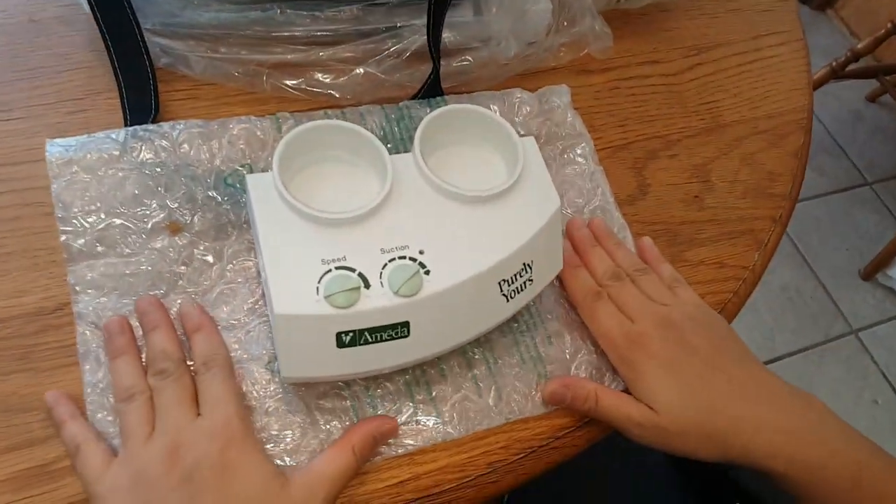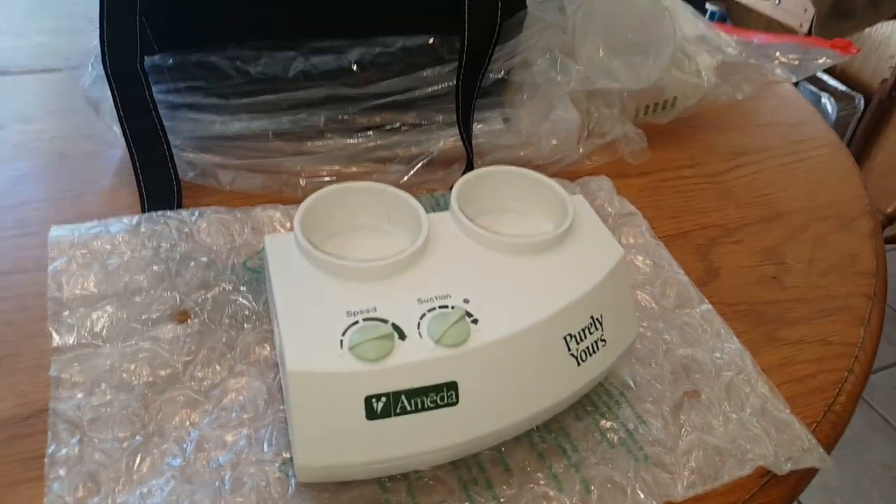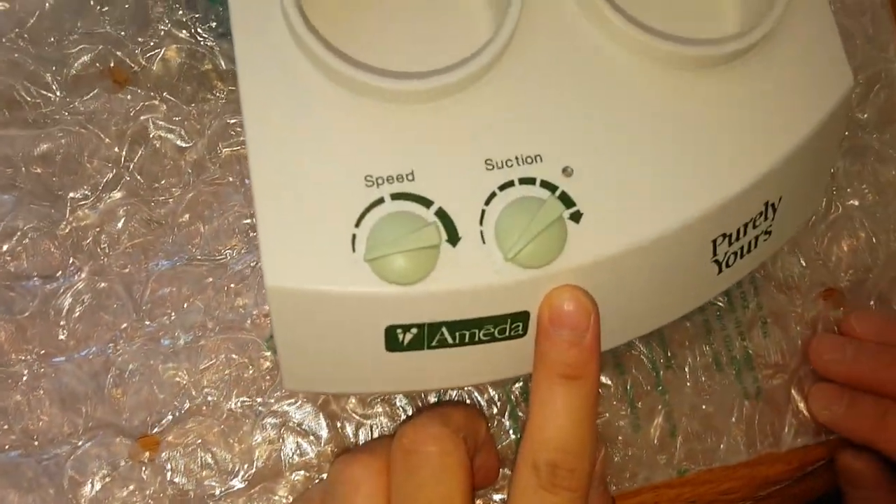This is how the breast pump looks. You have your speed on one side and the suction on the other.